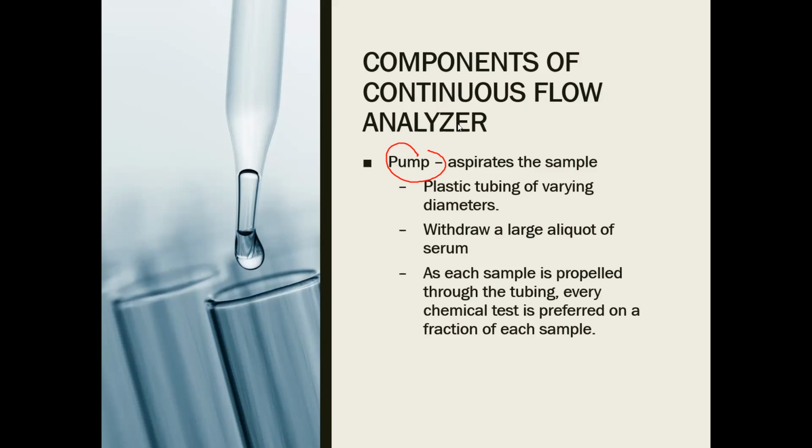One of the purposes of the pump is it withdraws a large aliquot of serum from the cuvette. No, it will just aspirate a sample for testing. And take note that each sample is propelled through the tubing. Even chemical test is performed on a fraction of a sample.